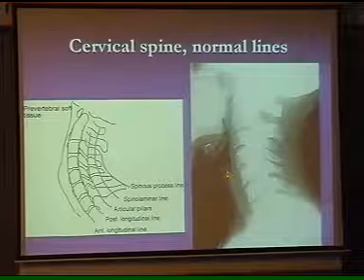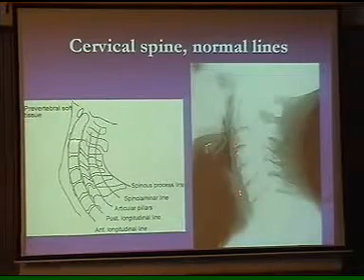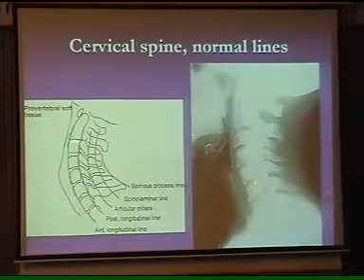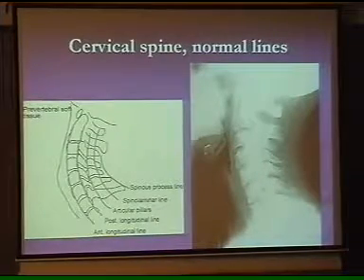If somebody has taken something, a fishbone or so, and that has involved the wall, the only thing appreciated will be increased space. Or if there is any tuberculous spine over there, the intervertebral disc space may be lost, but the more important sign will be the increased prevertebral space.